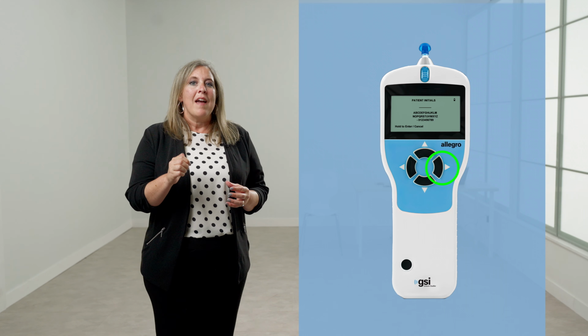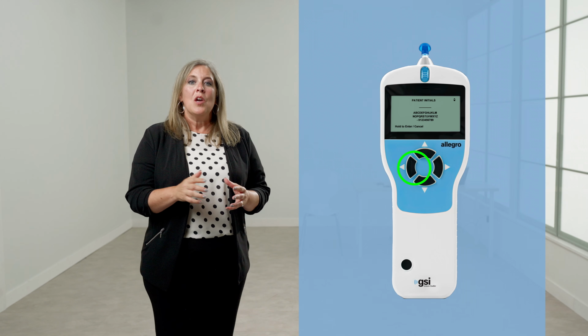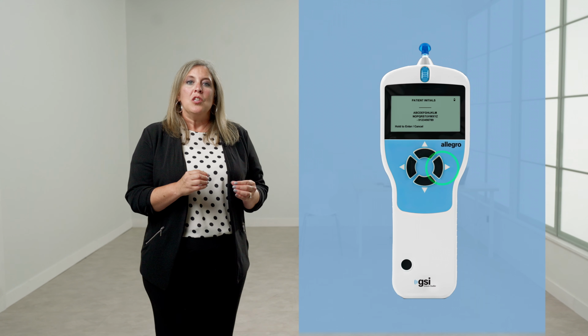Press briefly and hold the right button to enter a character. Press and hold the left button to delete the last character. When all 3 characters have been selected, press and hold the right button to save the record. Use the Data Management option in the main menu to view and manage saved records.